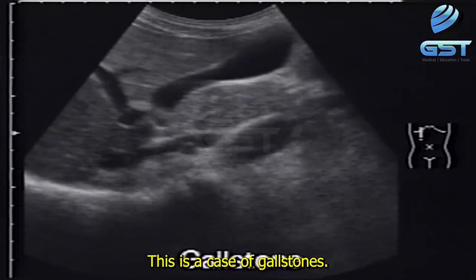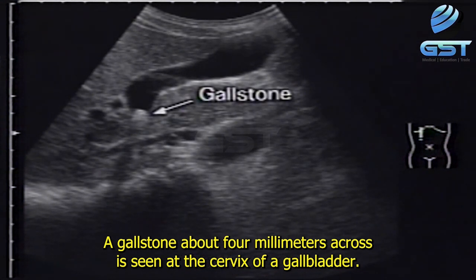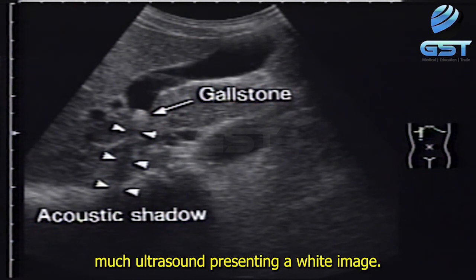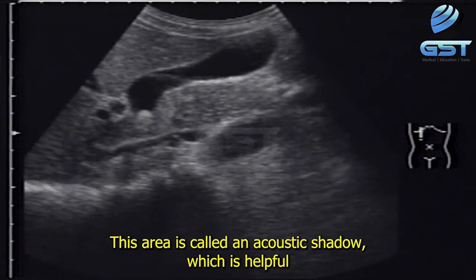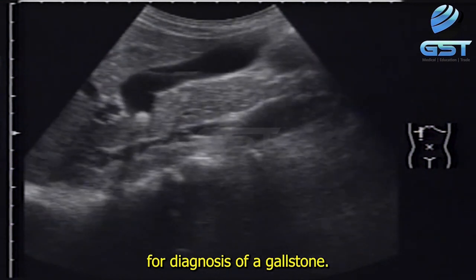This is a case of gallstones. A gallstone about 4 mm across is seen at the cervix of a gallbladder. A gallstone reflects much ultrasound, presenting a white image. A dark, no echo area appears behind a gallstone. This area is called an acoustic shadow, which is helpful for diagnosis of a gallstone.